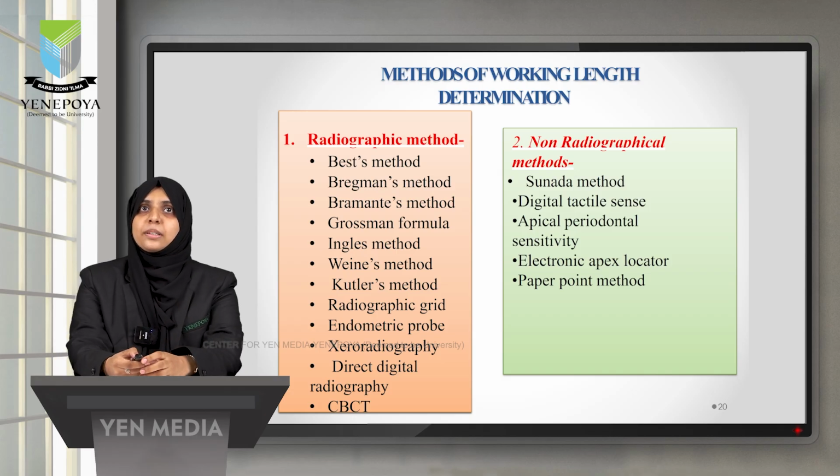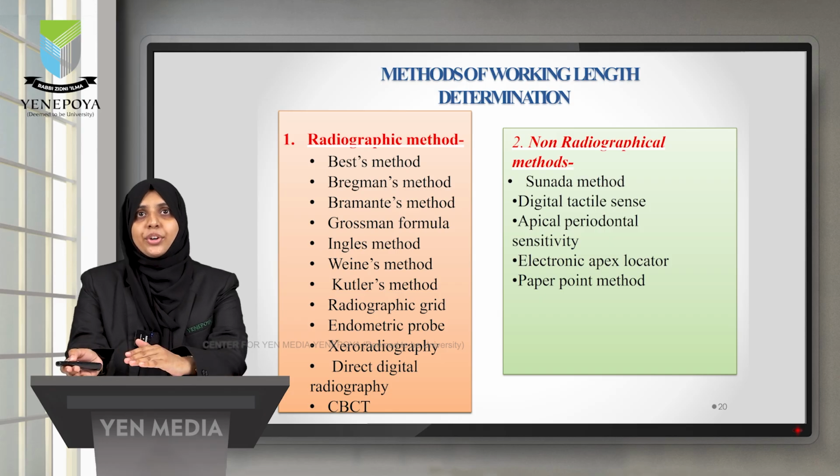Now let's move on to the various methods of determining working length. There is the radiographic method as well as the non-radiographic method.